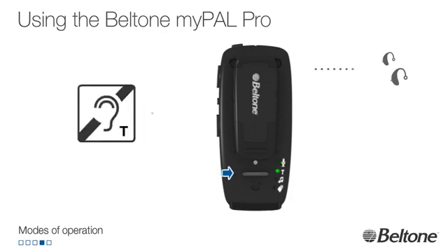An ear image appears with a letter T, and an arrow points to a button on the lower right of the myPAL Pro with the letter T.